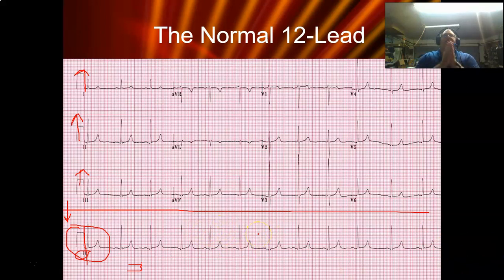Now, I will unfortunately tease you on this. When we start looking at some of the Bob Page stuff, he doesn't have any strip down below. But in a normal 12 lead, they usually have the diagnostic strip as the fourth row, so that you can tell exactly what rhythm this is. Again, it's a regular rhythm. The P to P's are the same. The R's are the same.